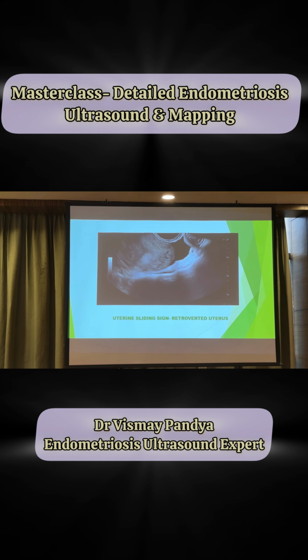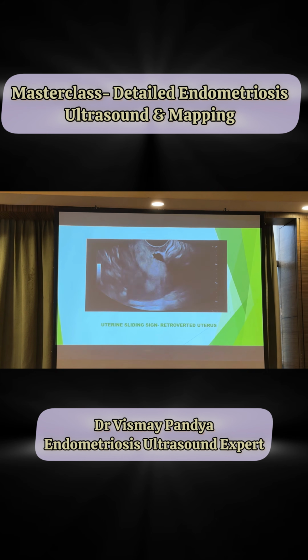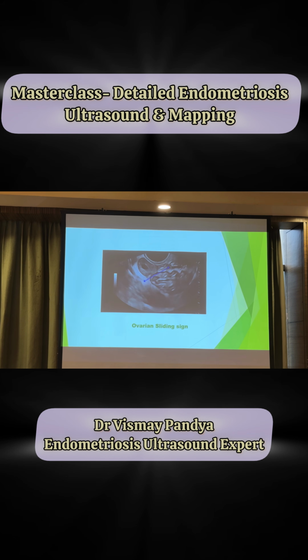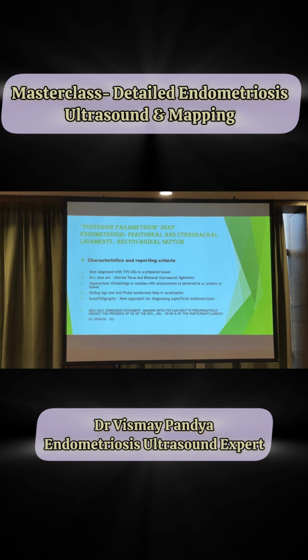So you can see the sliding sign test. This is for a retroverted uterus, where I have put the probe in the posterior vaginal fornix. As you can see, the POD is free and both the structures are moving away. This is the ovarian sliding sign. You can see the ovary and the sigmoid colon going away from each other. So it's a positive sliding sign.